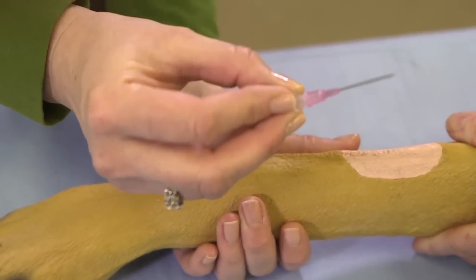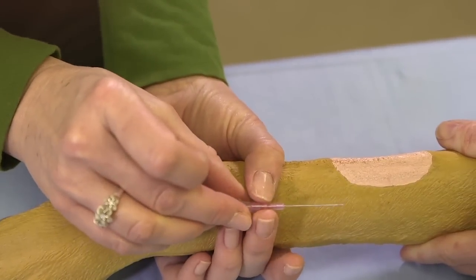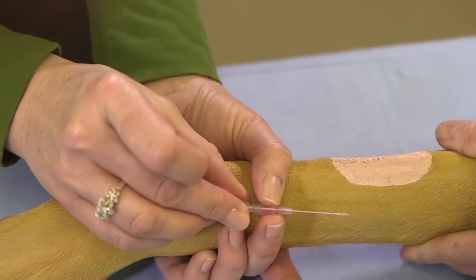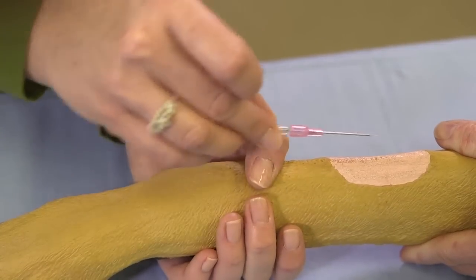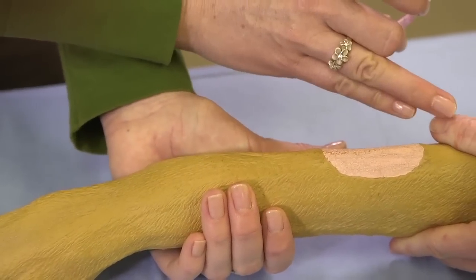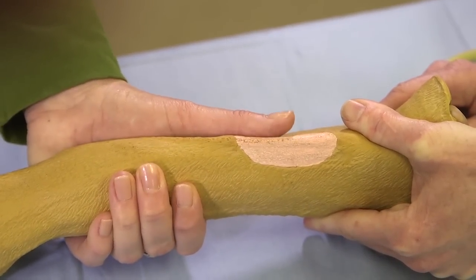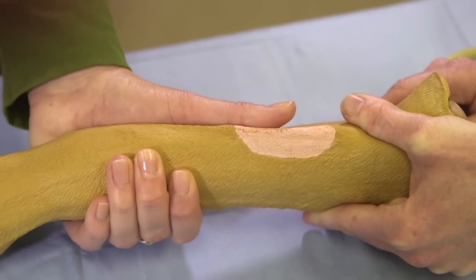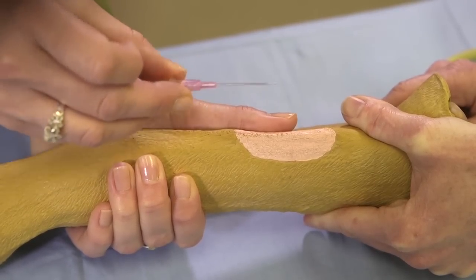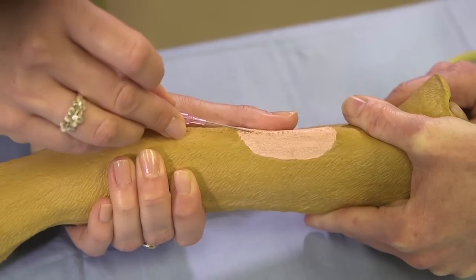Bevel up. You grab your stylet firmly. Make sure your catheter is all the way back onto the stylet — not coming up a little bit — otherwise you can't get into the vein. Grab your leg; your restrainer is squeezing and twisting that leg to make the vein pop up. Place your thumb next to the vein.